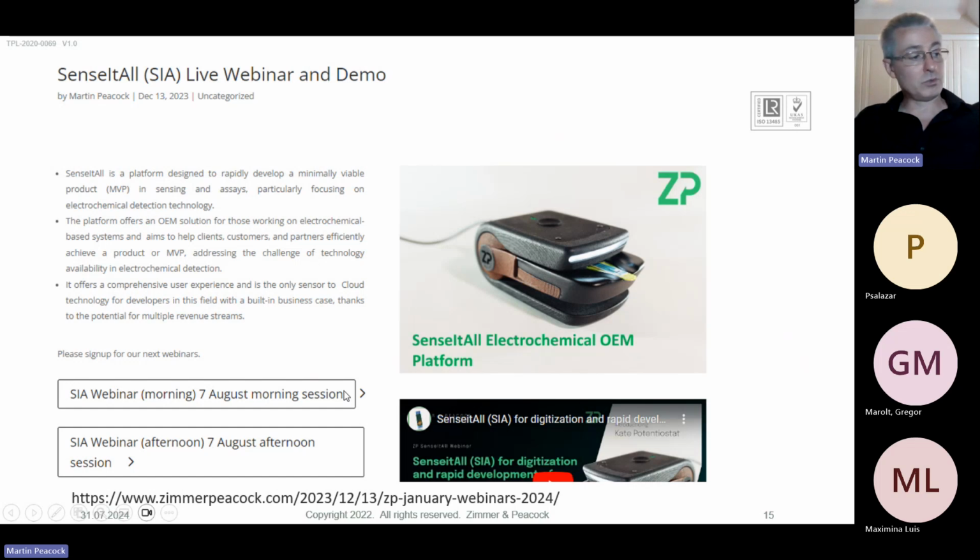Whereas when you're doing point of care diagnostics, you put a drop onto the end of this sensor, for example, at which point it's all very static, let's say. So you've removed a definite source of noise, but there's nothing more noisy than somebody running around in the real world. In fact, when you sometimes see data on wearable biosensors in papers, either the data was never gathered on an animal, that's the majority of the case.